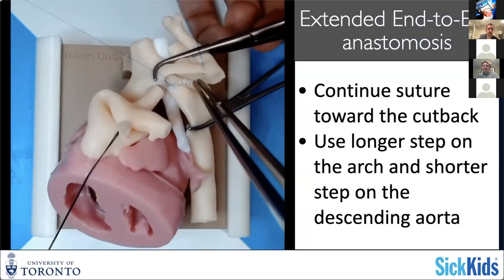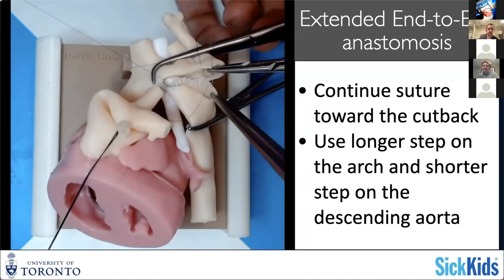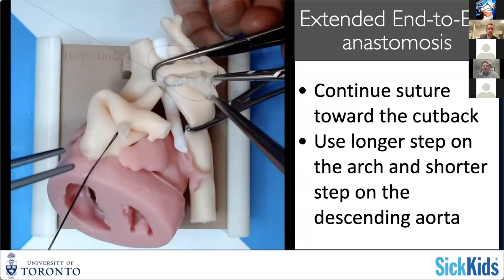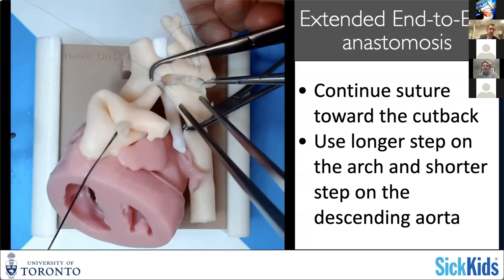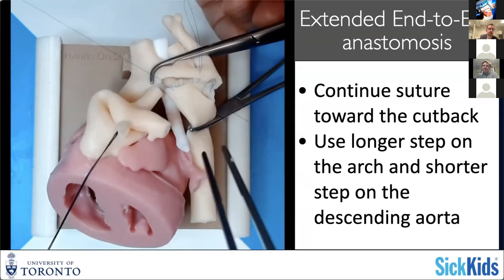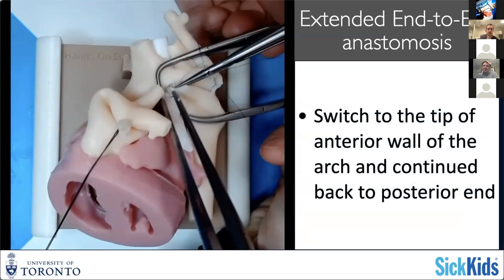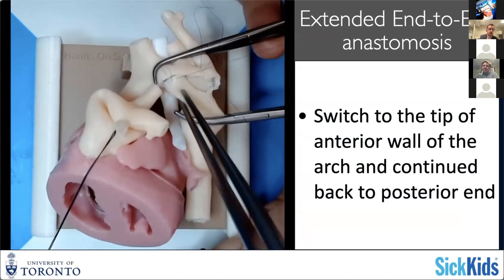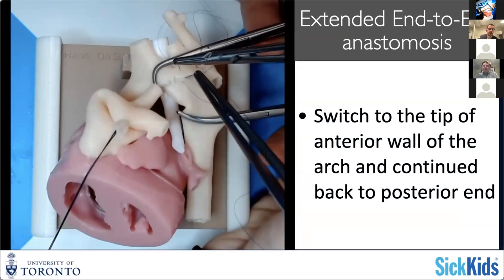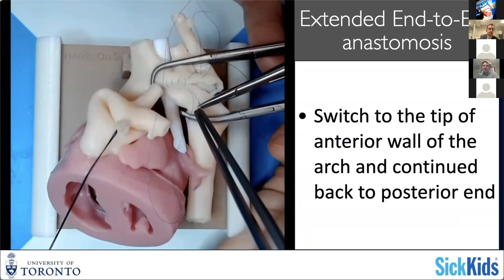You can see the additional incision made on the descending aorta — that's to accommodate and further enlarge the segment. Probably in this model you could have done a much more limited extended end-to-end repair and still been fine with the degree of tubular hypoplasia visible. But for teaching purposes, it's nice to show just how aggressive you can try to augment the arch, and you'll see how things come back together once the suture line is completed.